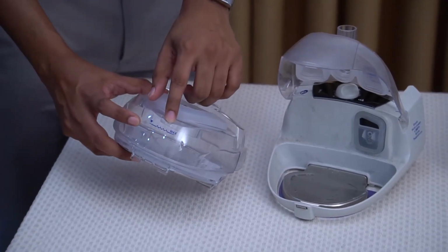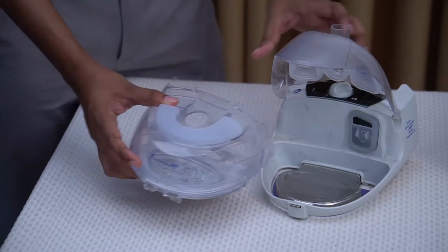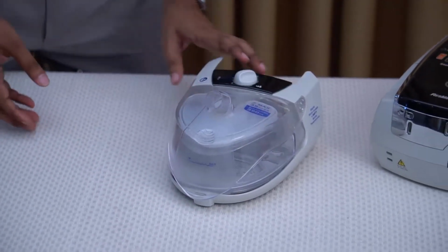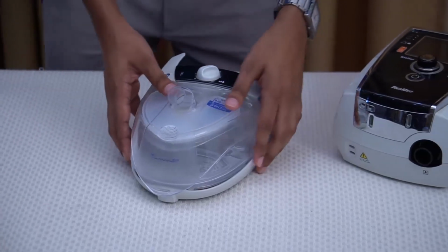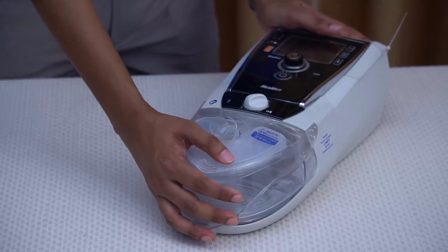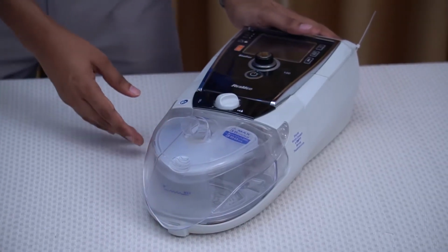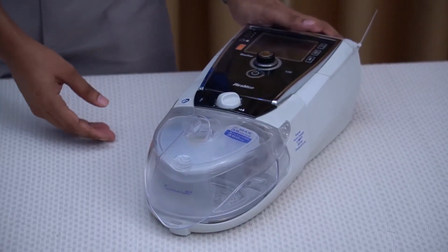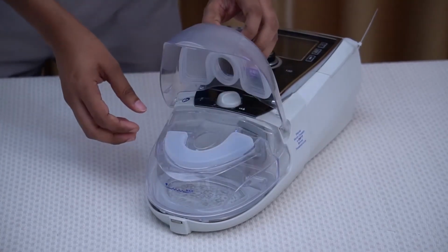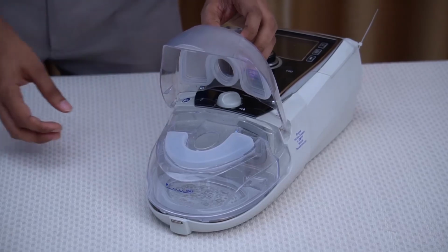Once you fill up the container, place it back and close the lid. Then we can connect the humidifier to the main unit by pressing it in. Of course, we do not need to remove the humidifier to fill up the water container.